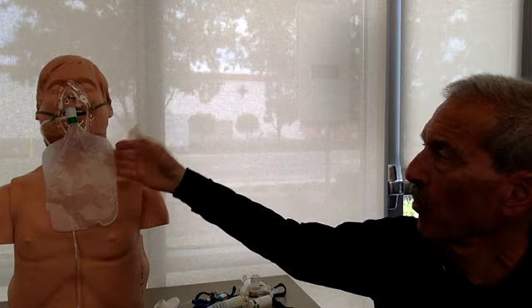his tidal volume seems to be somewhat adequate, and you're thinking, okay, breathing problem, put some high flow O2 on him. So you put a regular old non-rebreather on, 15 liters per minute, you're doing your assessment, you're getting your blood pressure, your other stuff going on. 4 or 5 minutes goes by, and you notice, gee, saturations really haven't risen all that much. They're a whopping 82% now on the high flow O2. So again, that's telling you there's a disconnect between what air is getting in and what air is getting through the alveoli. So now you know this is probably a problem for him.